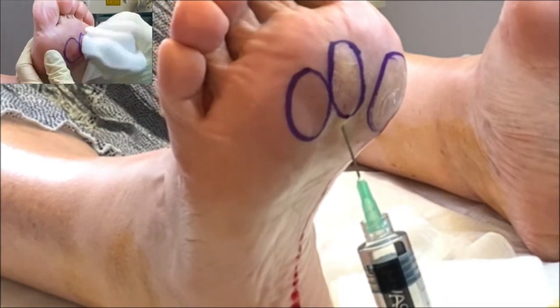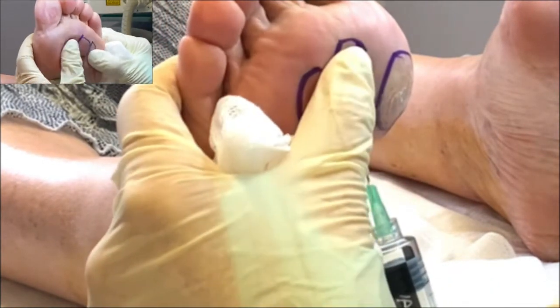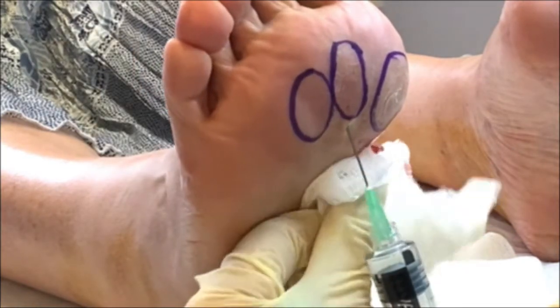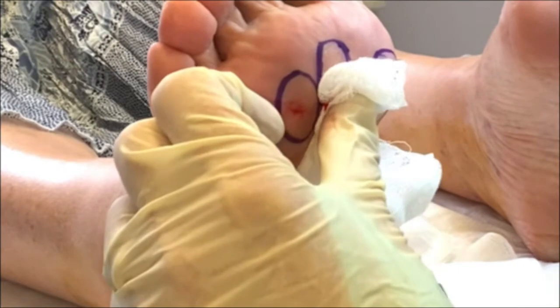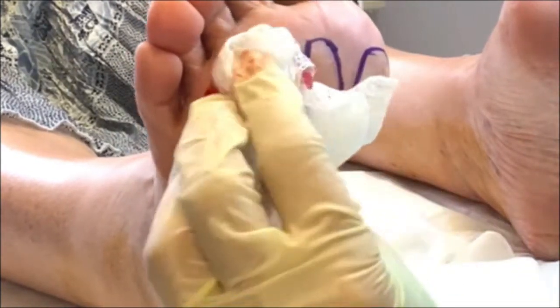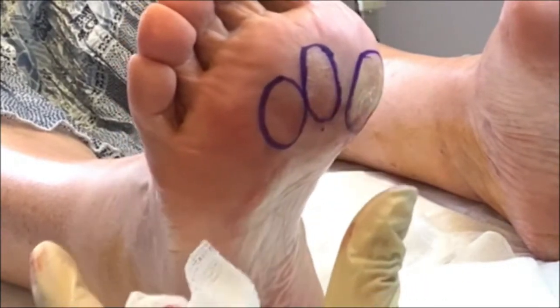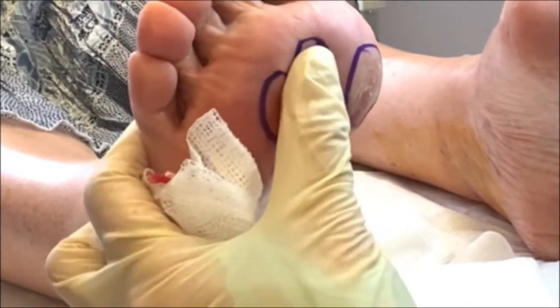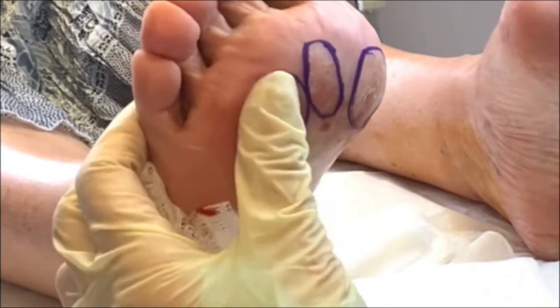And you can see it, there it is — can you see the photo there? Just beautifully filling. Let's just gently take that needle out. That's looking beautiful — when I press it, look, it just nicely plumped up.